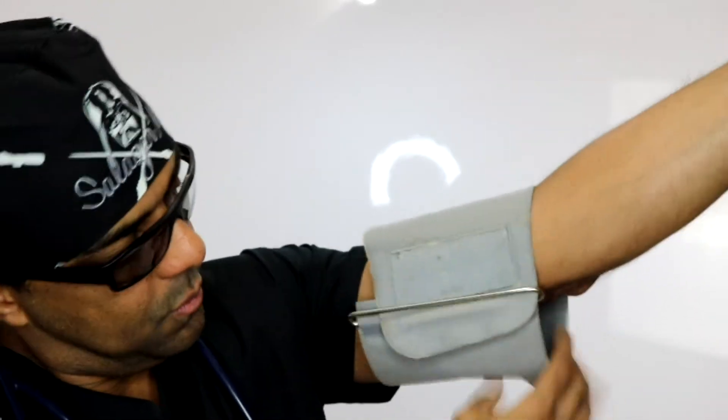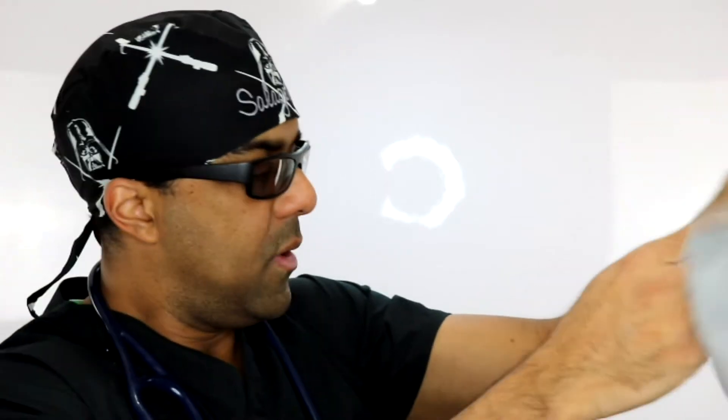When my patient came into the office with his machine, the first thing I noticed was that he put the cuff on backwards — with the holes basically at the back of the arm. Obviously that gives you a totally bogus reading because there's no brachial artery back there. Then he did it again for me and this time he put it on upside down, with what's supposed to be down here up at the top.